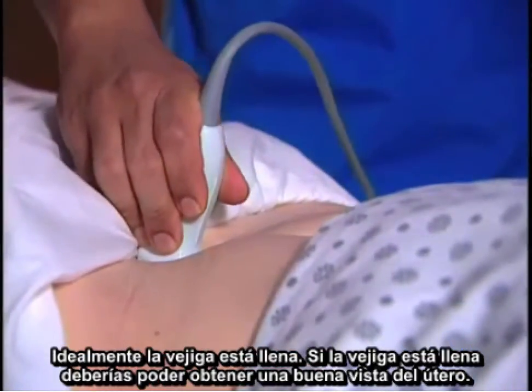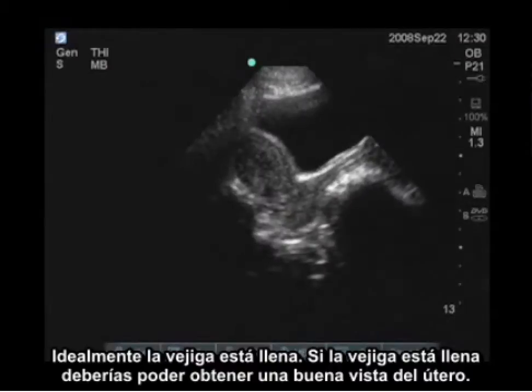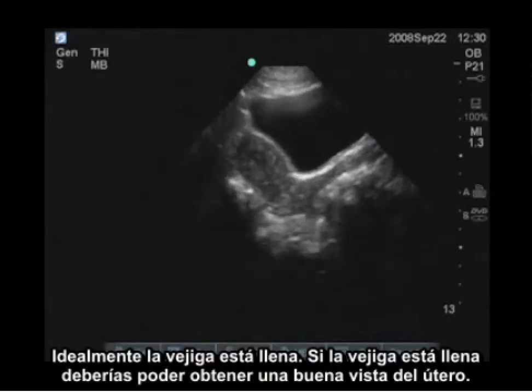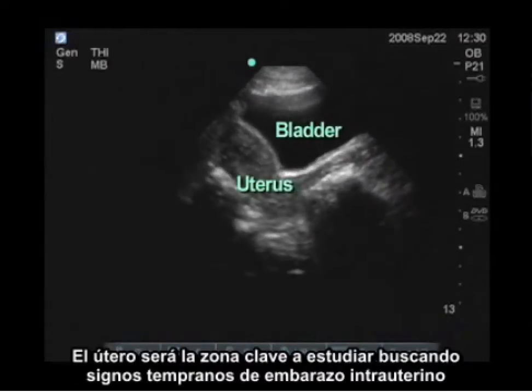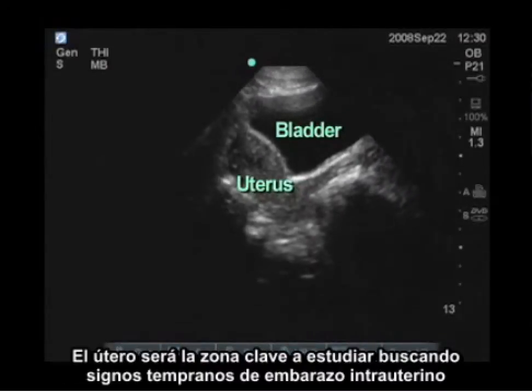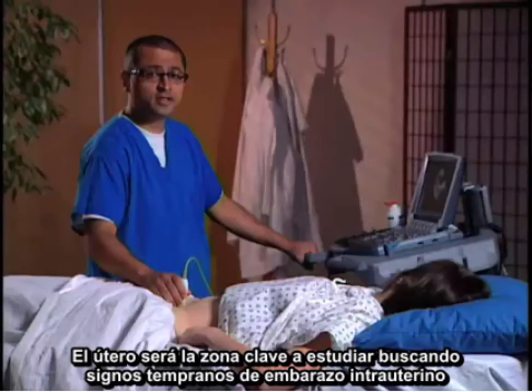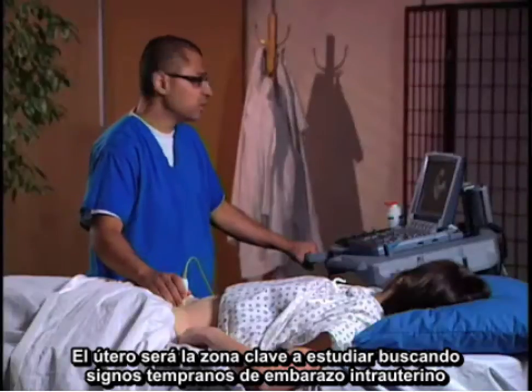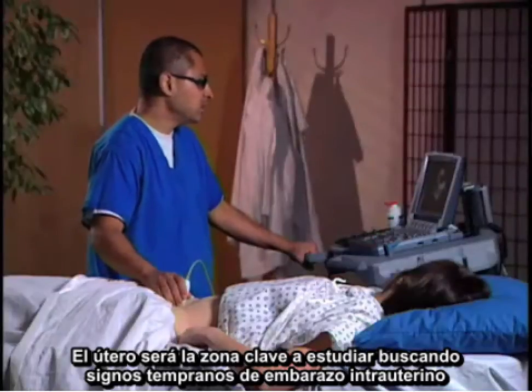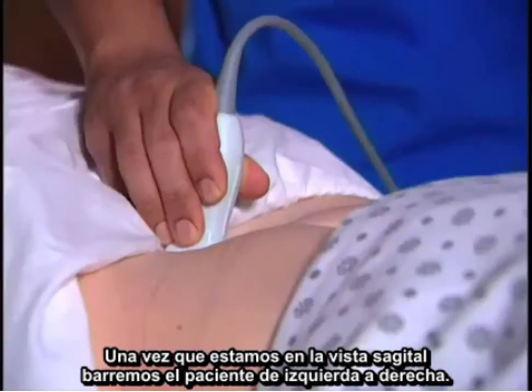Ideally, the bladder is full. If the bladder is full, we should be able to get a good view of the uterus. Through the uterus, it will be the key area that we're going to interrogate and look for early signs of an intrauterine pregnancy. Once we're in this sagittal view, we're going to scan from the patient's left to right.